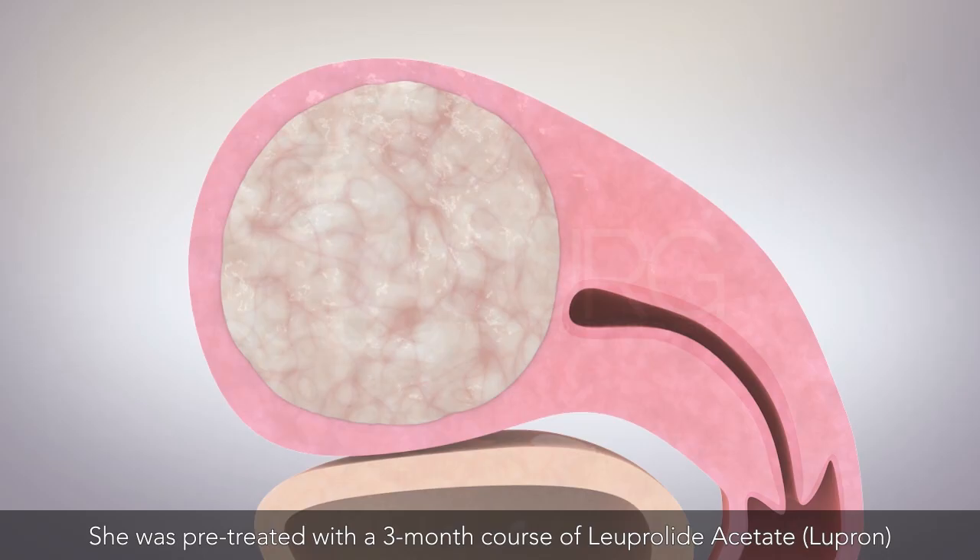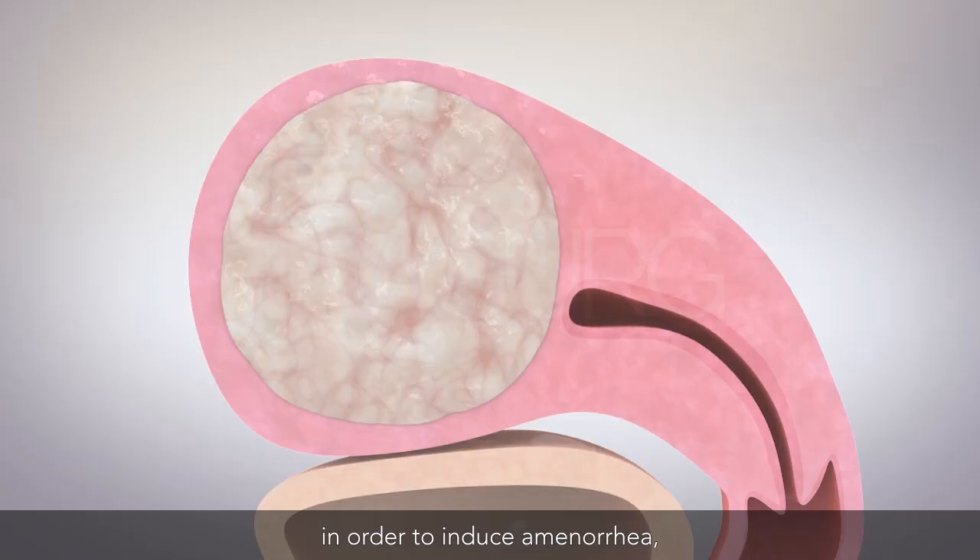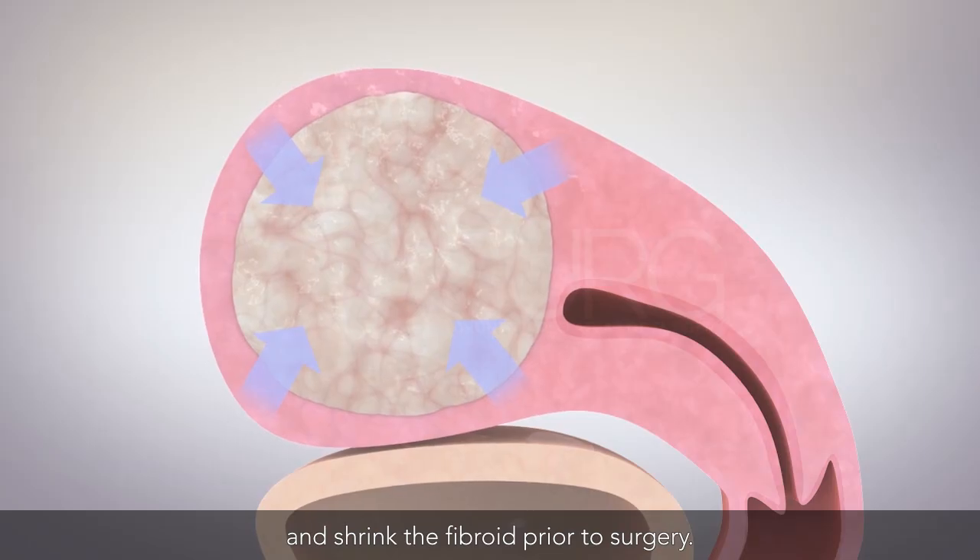She was pre-treated with a 3-month course of leuprolide acetate (Lupron) in order to induce amenorrhea, optimize hemoglobin, and shrink the fibroid prior to surgery.